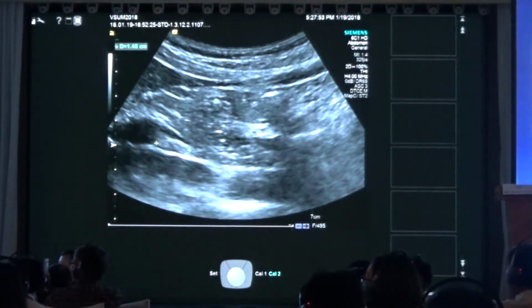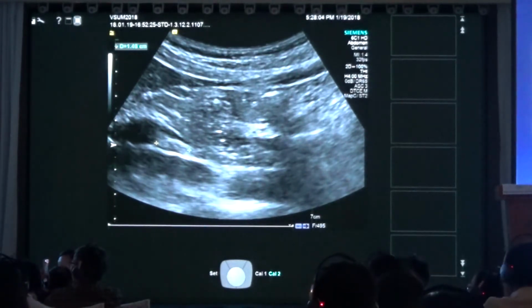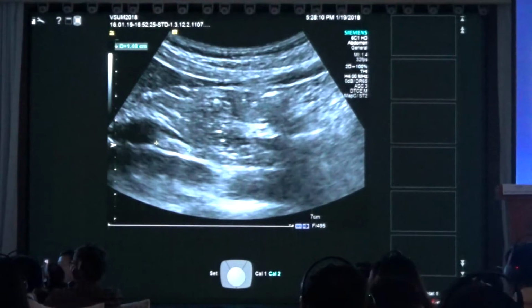I love very much the comment, just to say, transient elastography is done even independent of the respiration, in mid-respiration. Point shear wave elastography can be done in such a patient in mid-respiration with very small movements, it's quite nice.